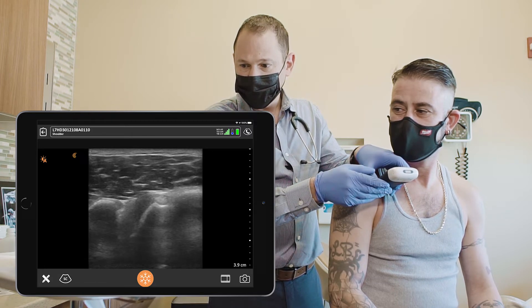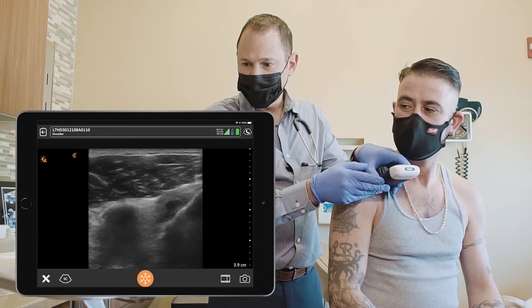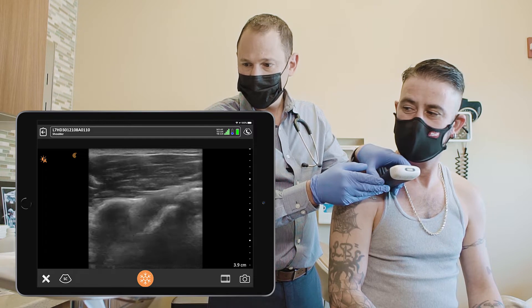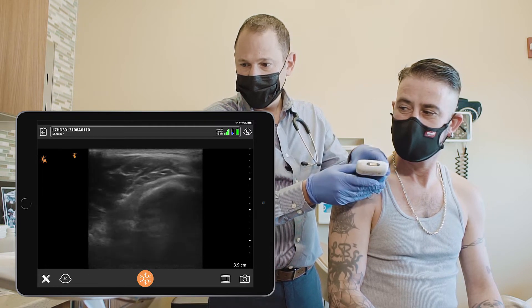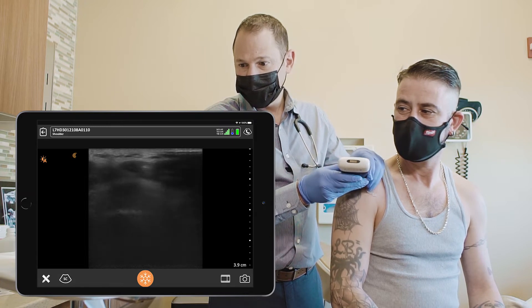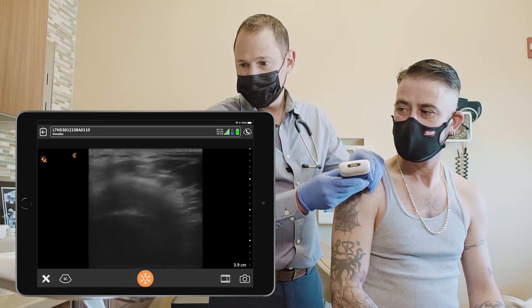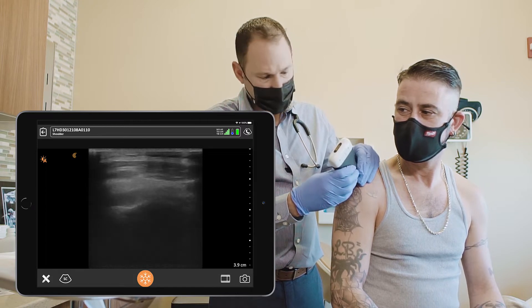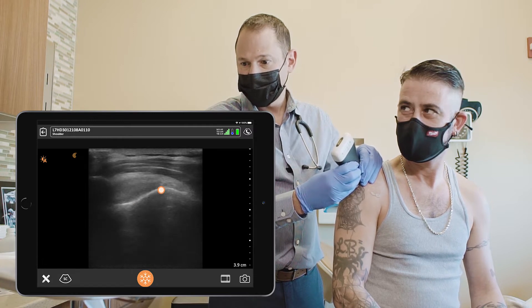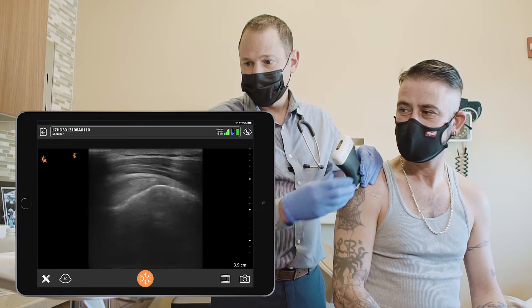Overlying the biceps tendon, moving upwards and medial, you can see the glenohumeral joint — the anterior view. Coming lateral, you can identify the humeral head underneath the acromion. When you turn it 90 degrees, you should be able to see the supraspinatus tendon and the sub-deltoid bursa, which is the black line above the tendon.